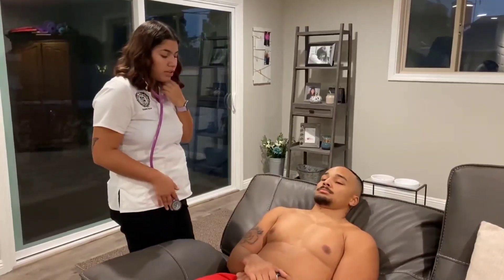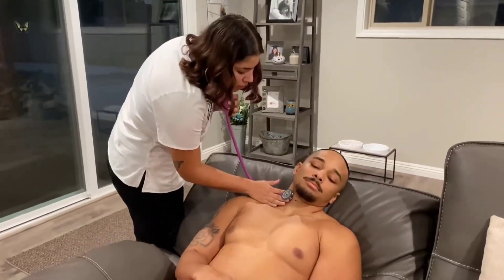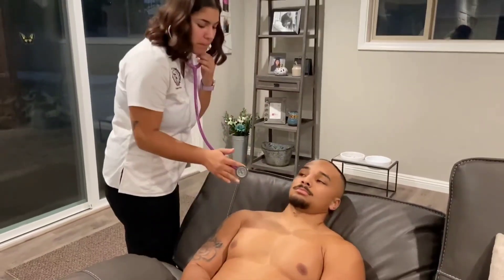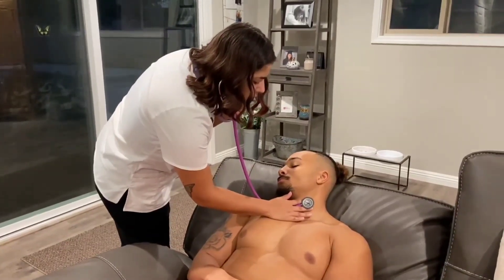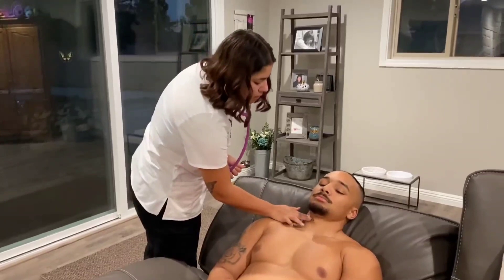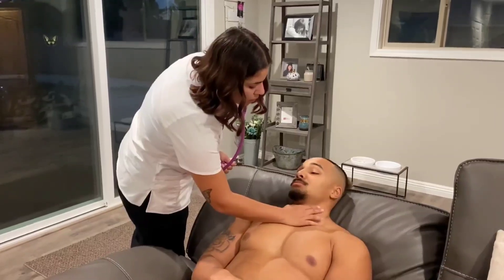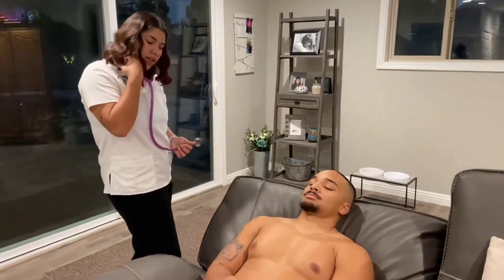Now I'm going to auscultate the carotid arteries. The carotid arteries were auscultated — there are no bruits or murmurs heard. The pulse bilaterally was 1+.